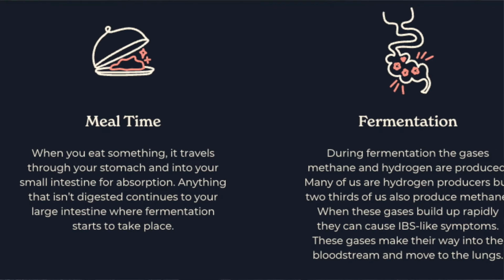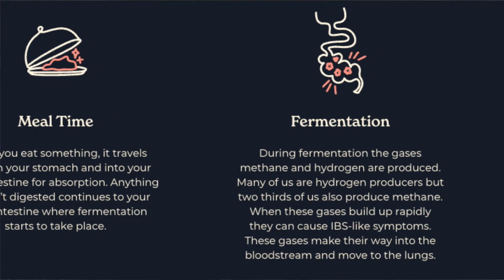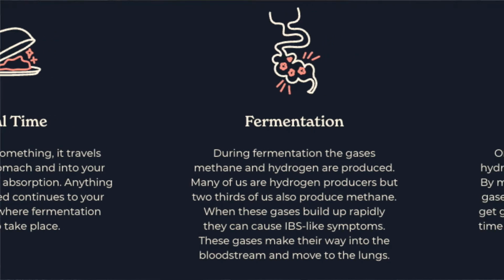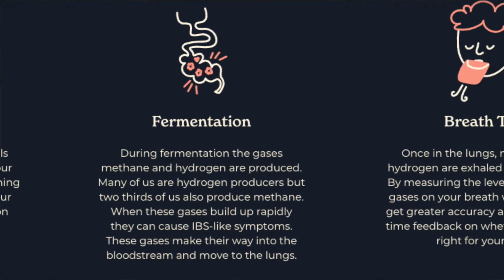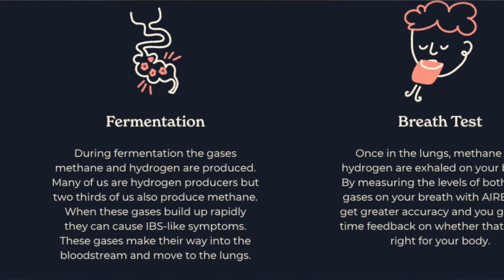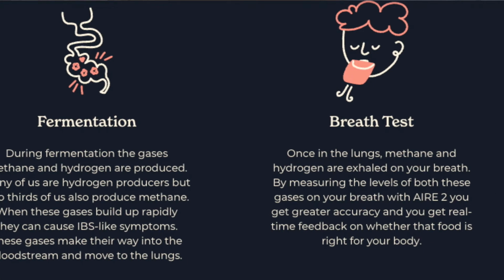The way that it goes is super simple. You eat a food, you do your breath test over I think it's a span of like 3 hours. Again, I would have to read all of the directions in detail because this could be a little bit different for the brand new kit. But what you would do then is over about I think 3 to 4 hour period, you would measure your breath and your results would pop up in the app.